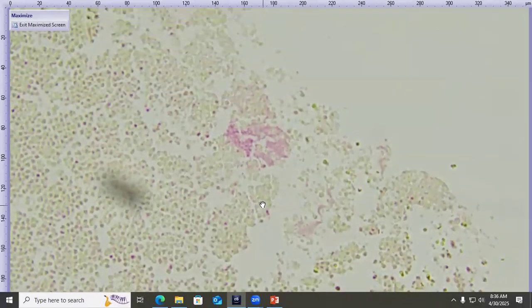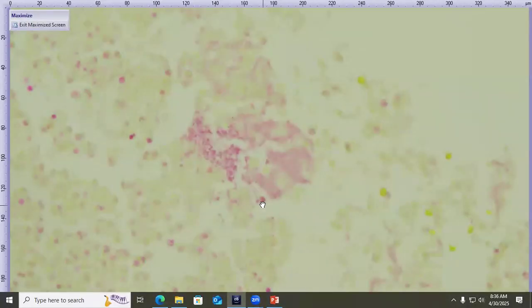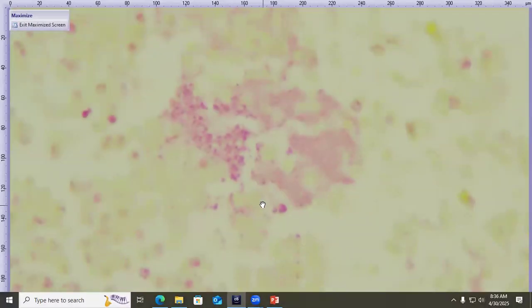I did do a gram stain on this just for fun. See what we could get. There's a good number of them admixed. And there may be sometimes kind of more elongate bacilli or so, gram negative, or maybe filamentous. It's kind of a variable morphology maybe. But regardless, we've got bacteria in here, as expected. They were also not acid fast, for what it's worth. Just curious.